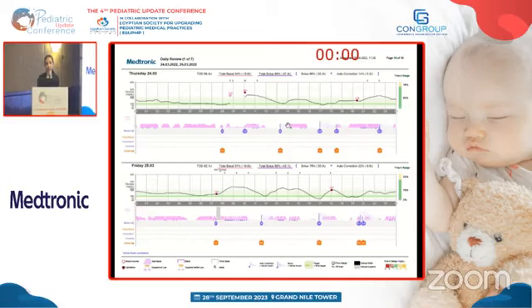اوكي بعد كده في داي 1 هنا البيشنت اخد كاربس تانيين، حصل سلايت هايبرجليسيميا كان بسيط، ادينا هنا تحت اوتو كوركشن عشان ينزل للنورمال رينج. فهنا السيستم بيدي اوتو كوركشنز، هلاحظ ان هي تبقى بعد الميلز، فده بيخليني دايما اكونسيدر زي ما اتفقنا الميل بولسز واشوف ايه سبب المشكله اللي موجوده.